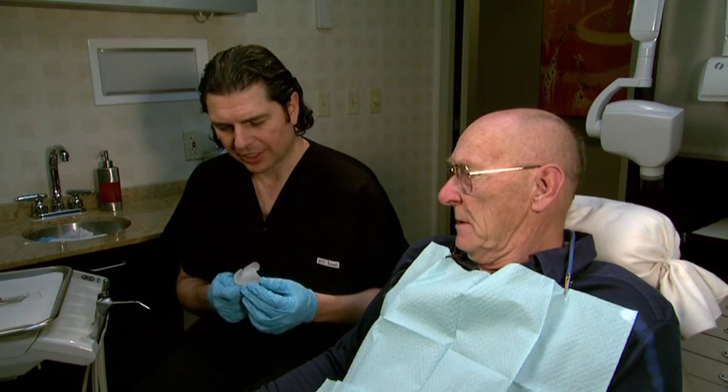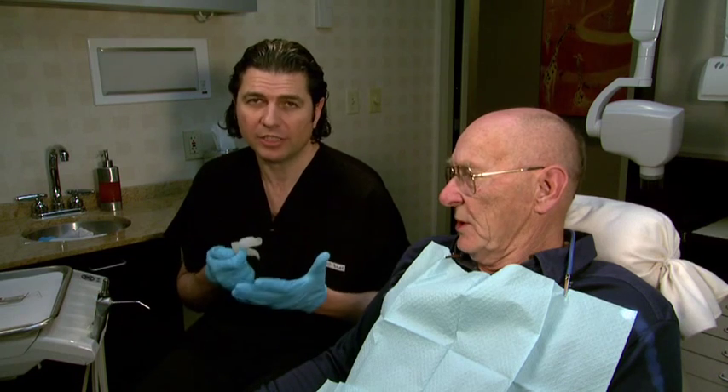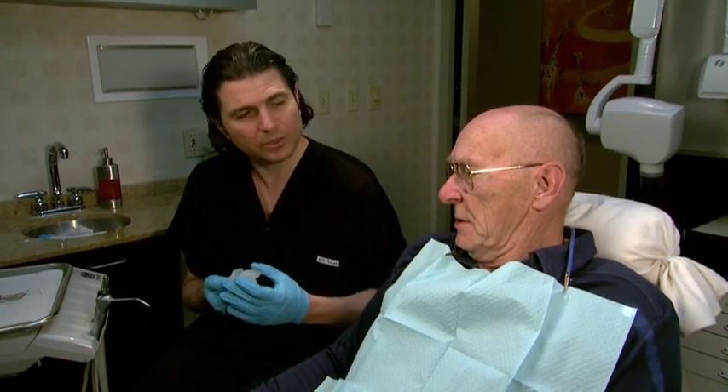We've just finished the laboratory section on fabrication of a secondary impression tray and we're ready to try these trays in Lou's mouth. This is Lou's appointment number three.